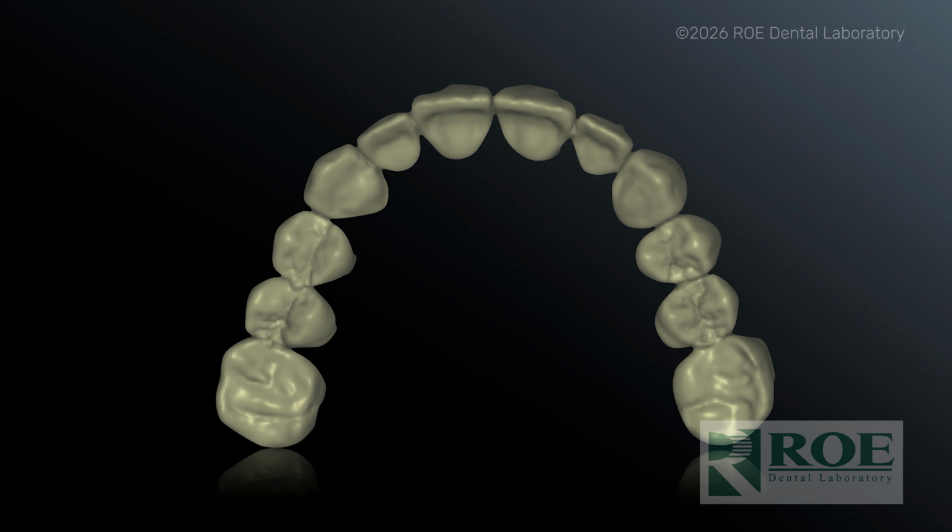And what I would recommend on your first case, I would prep the teeth. I'm going to have my mock-up already, and I'm going to make a putty index, and I'm going to do the old shrink wrap PVS temporary that you've always done. And I'm going to kick the patient out the door, say, hey, dude, I'm going to see you tomorrow. I don't really care how the tissue looks, I literally just lock it on, put it on, trim it up a little bit, get out of here.